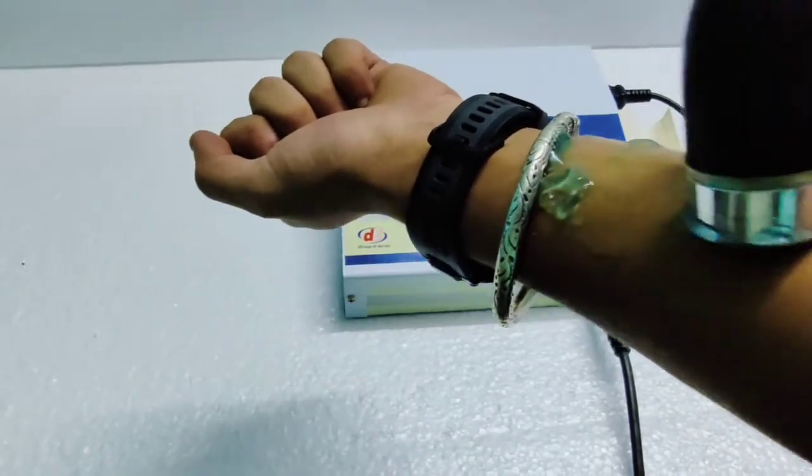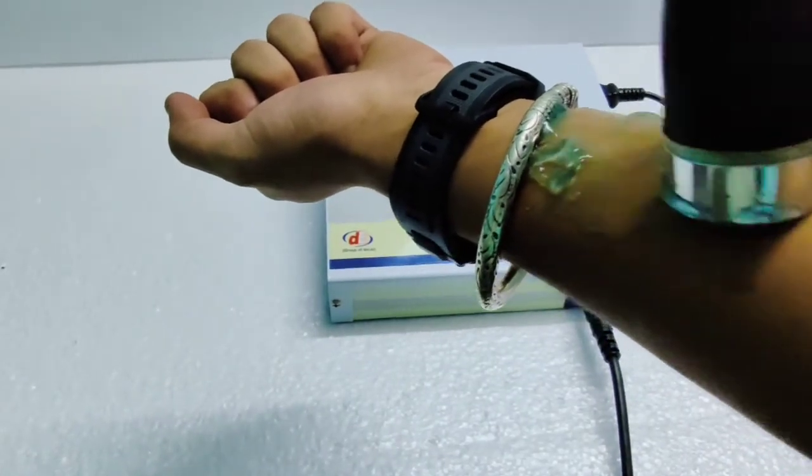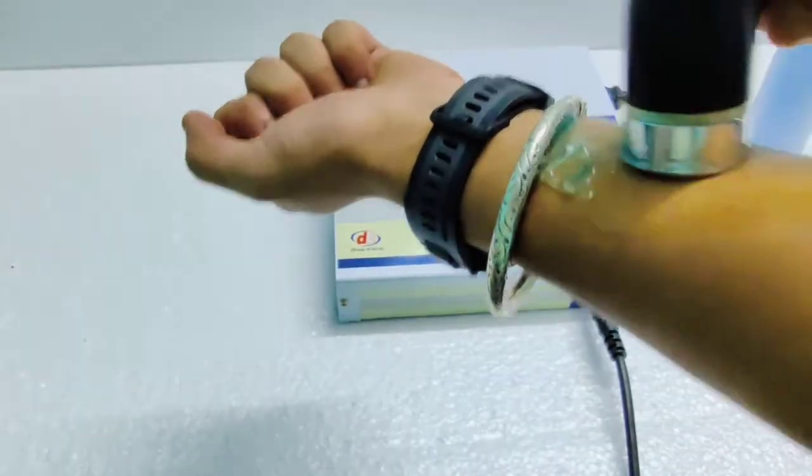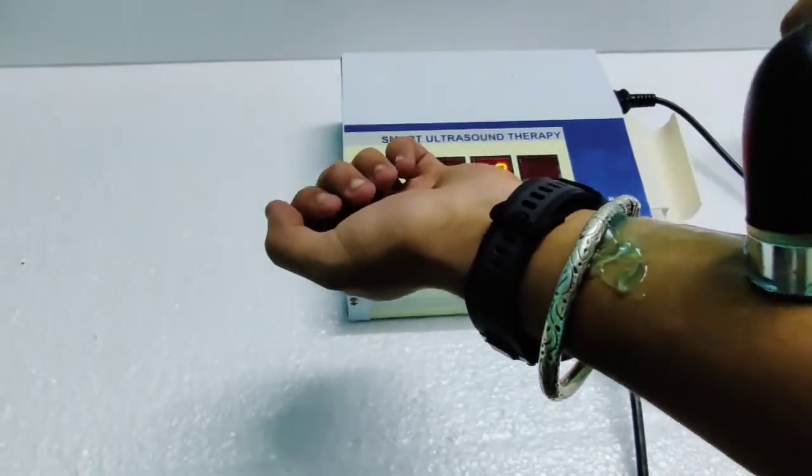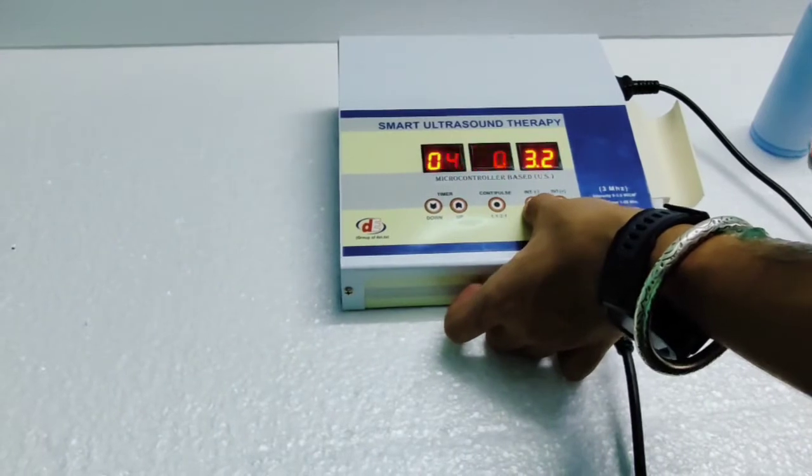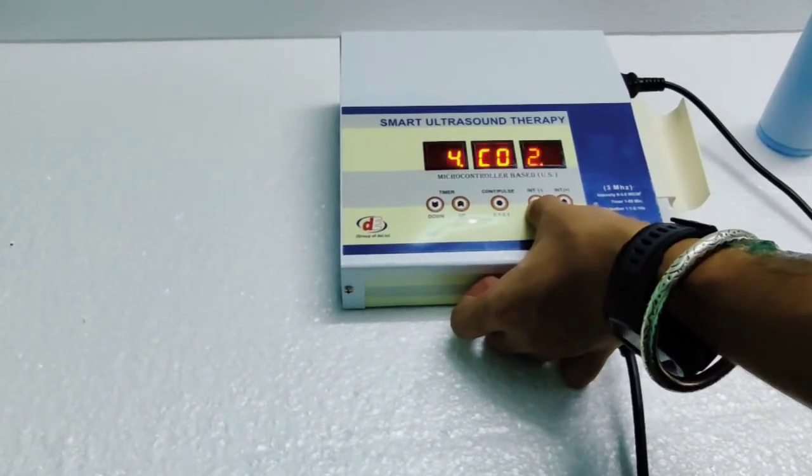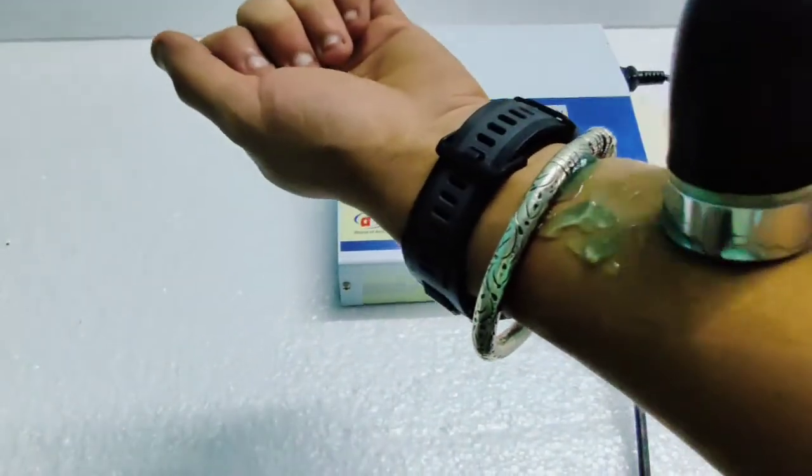I started feeling heat. You can also decrease the intensity if you feel too much heat and then start again.